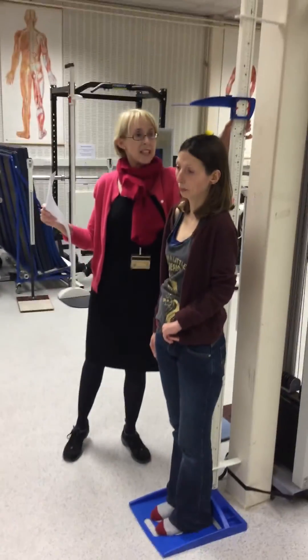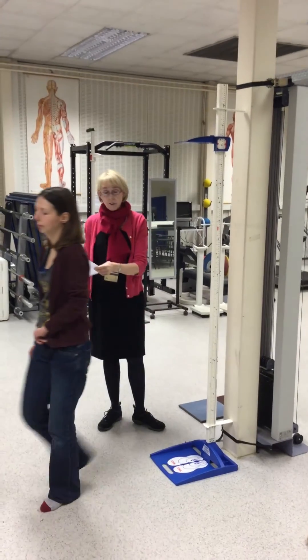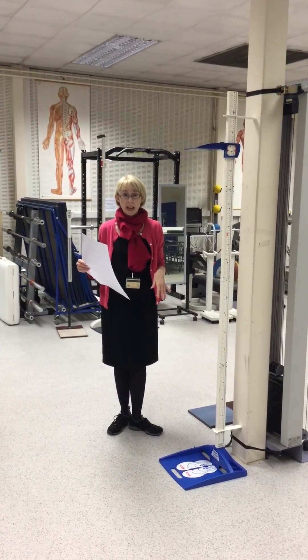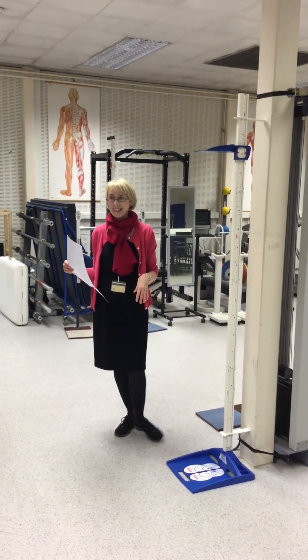The next thing we need to do is just raise this up and then ask the subject to step down. Thank you, Lee. And finally, just repeat the measurements twice so you have three readings and then take the average of all the readings together. Thank you very much. Thank you, Lee.